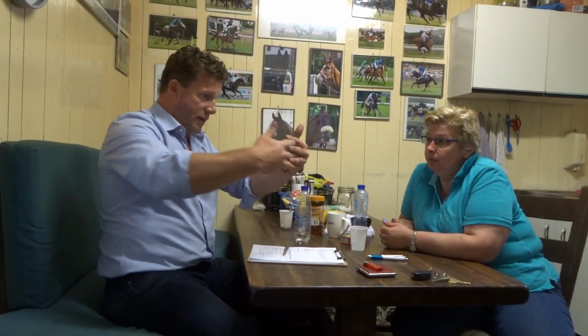So the green fibers are basically the most elastic ones, and they slide. If you look at it like that, it's like fibers sliding along each other. And a normal tendon, if they're strained, will do this and come back. Now, blue on the tissue characterization scan would be fibers. They're organized, but not fully organized. So they're cross-linked a bit. So they're not as flexible. So what you get is, if this is pulled, it doesn't stretch as much. The elasticity is less, and it's more tending to break. It might not break. It might just break a bit.